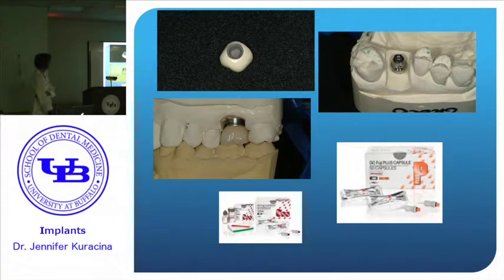Typically here that constitutes either a glass ionomer or Fuji Plus. And I think the cementable abutments have a screw channel. You can either have them place a cotton pellet and firm it, or I think, are we getting Teflon tape, did you say? We will have Teflon tape available if you want to use that. But if there's a screw, then you should block it out before cementing.